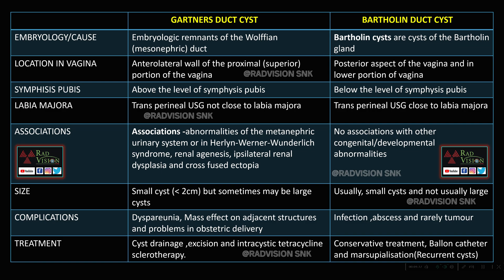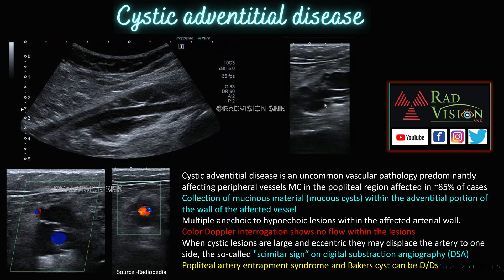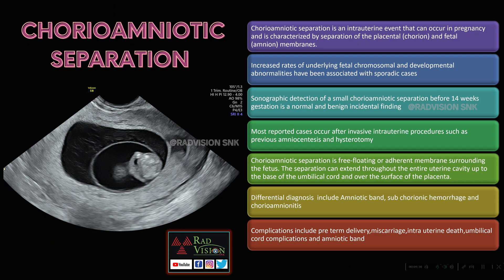Next case: here you can see this is the amnion, this is the fetus, and the amnion is not completely fused with the chorion. There are multiple echoes noted between the amnion and chorion. Whenever you see this picture before 14 weeks, it is a normal and incidental finding. But after 14 weeks, it is definitely considered as chorioamniotic separation.